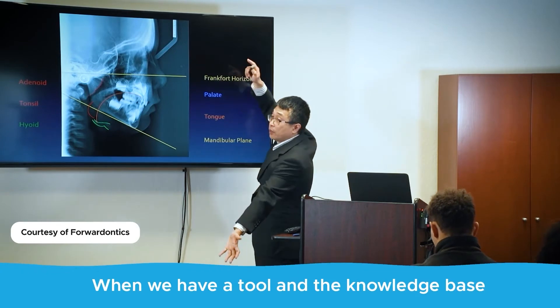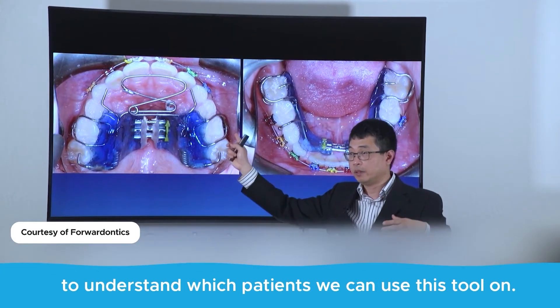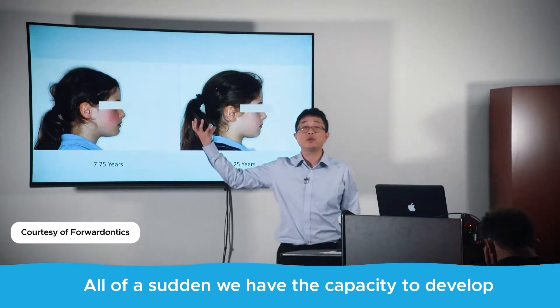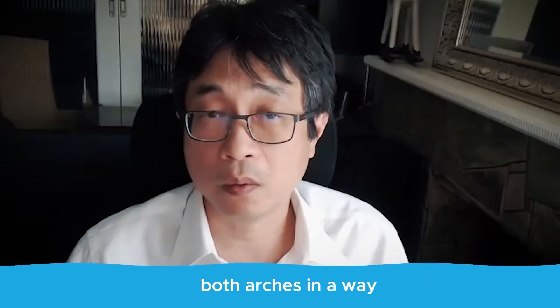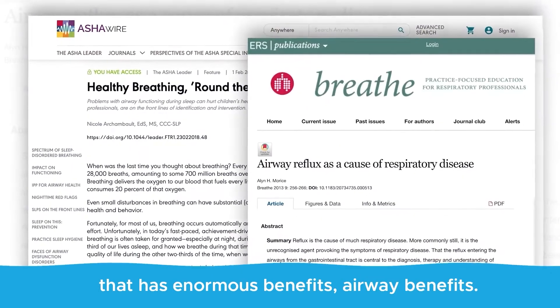When we have a tool and the knowledge base to understand which patients we can use this tool on, all of a sudden we have the capacity to develop both arches in a way that has enormous benefits — airway benefits.